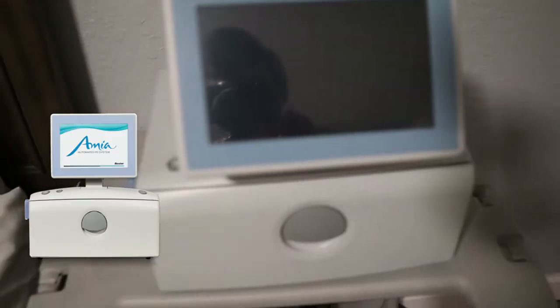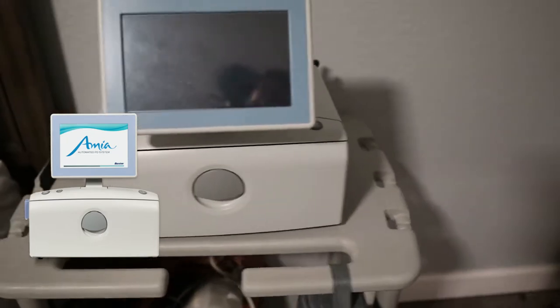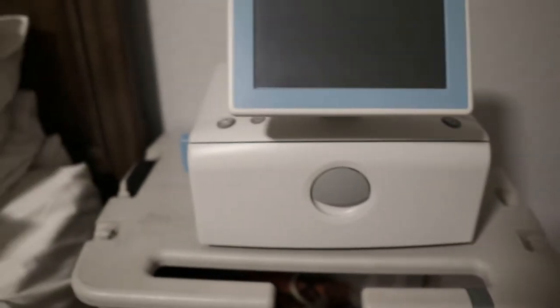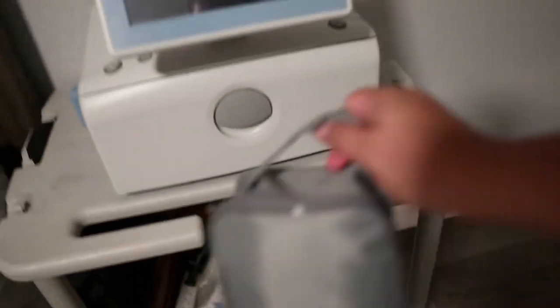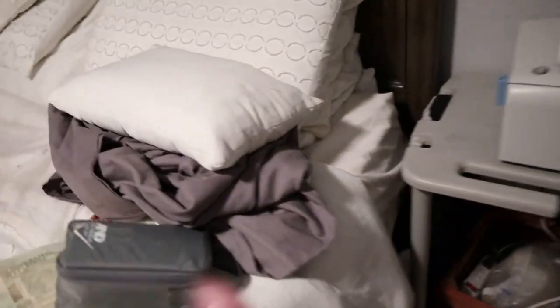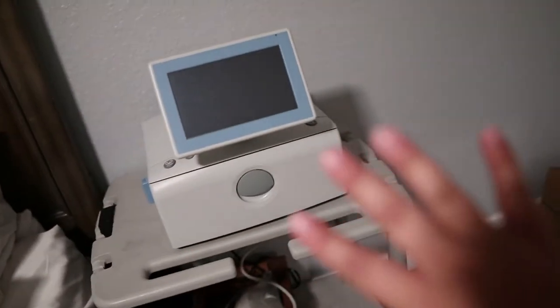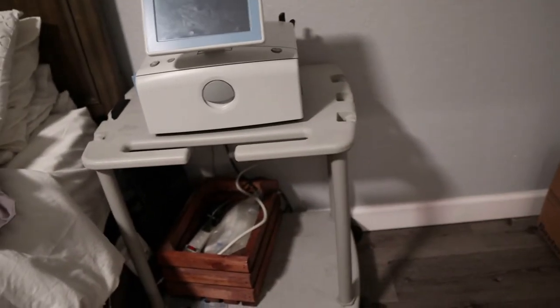The first thing I want to show you is our setup. There is a blanket on top of the machine — and I'll tell you why in a second. The name of this machine, or the brand, is Amia, and the supplies that we use are from Baxter. The reason we have a blanket is because we've never been able to figure out how to get it to go into sleep mode — this screen turns on and it is so bright we can't sleep at night.